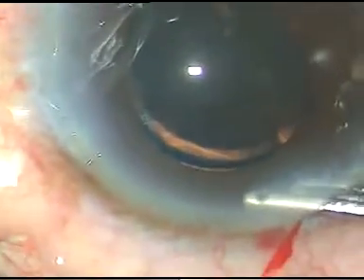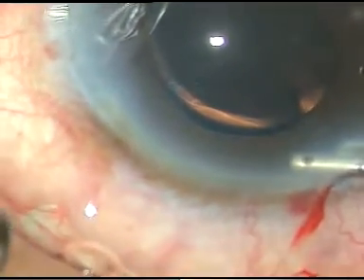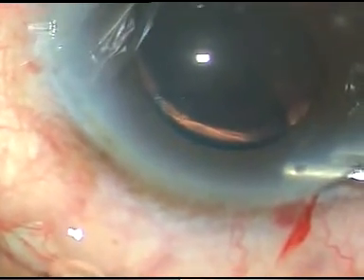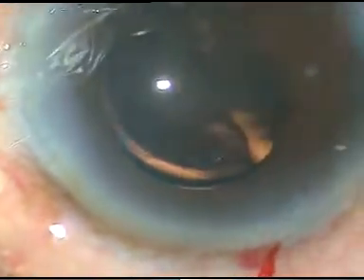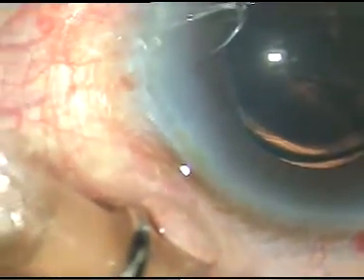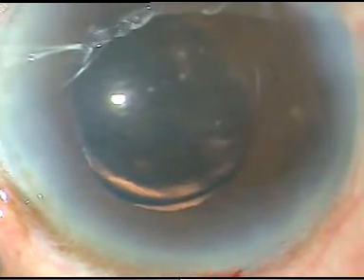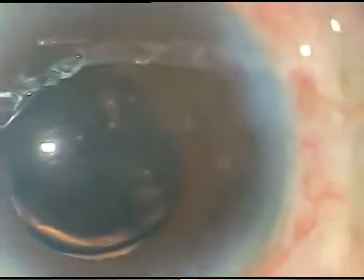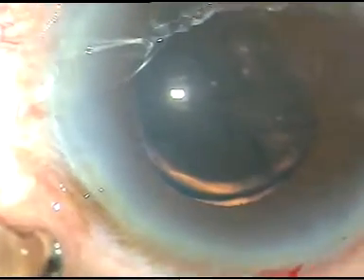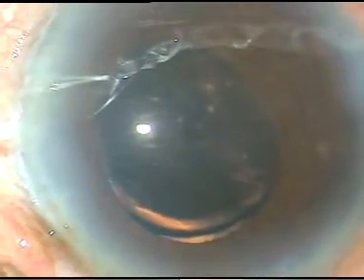Now what I am trying to do is, if there are any vitreous strands, if there is any viscoelastic substance, it should come out by just irrigation. I am not going to aspirate with the Simcoe cannula.